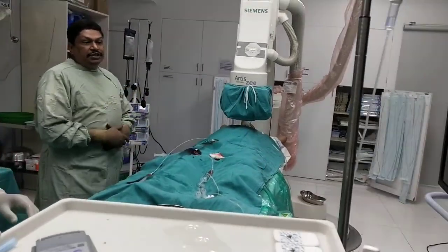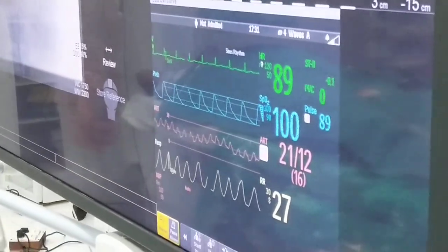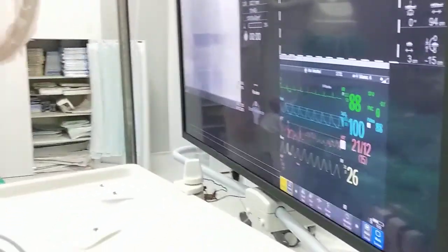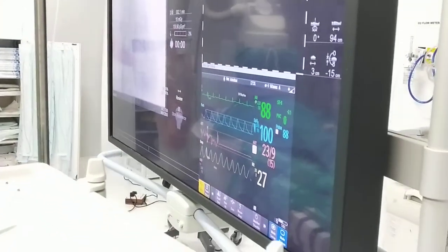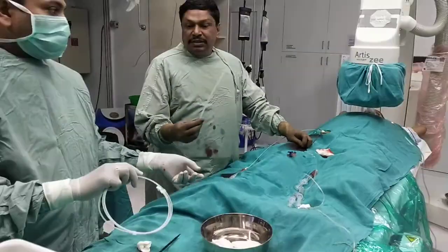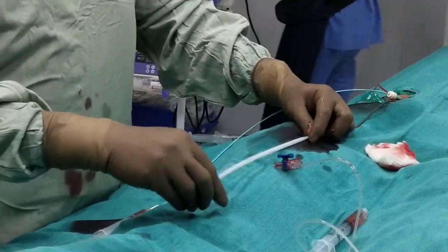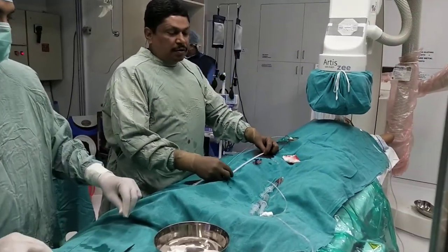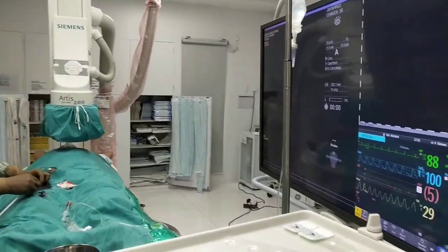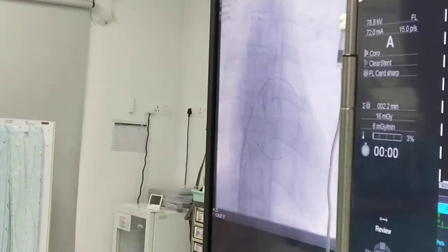We are checking the pressure, which comes around 27–28, and we know normal is 14–16, so she has slightly elevated filling pressures. Now we are putting the spring wire, which will be curling inside the left atrium and will support the balloon. This wire is put into the left atrium and is properly placed with the coils formed.